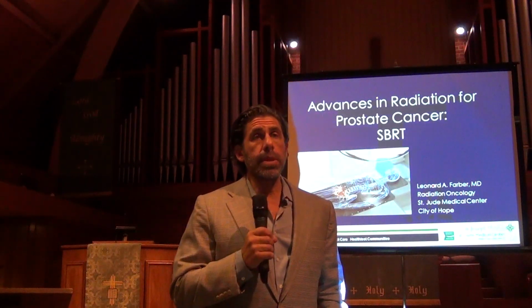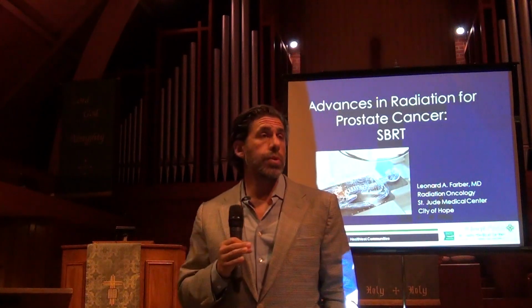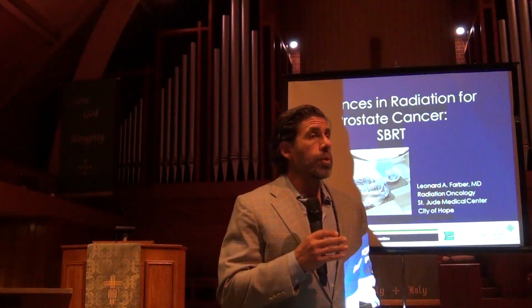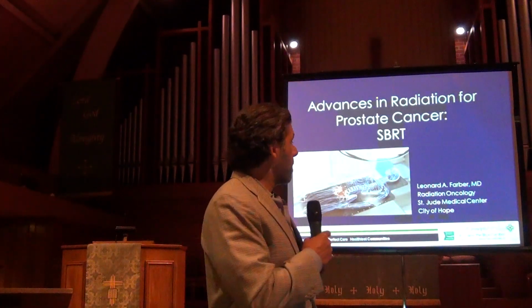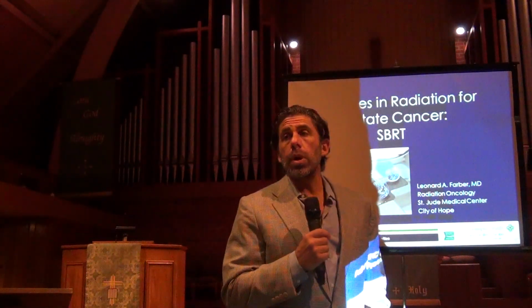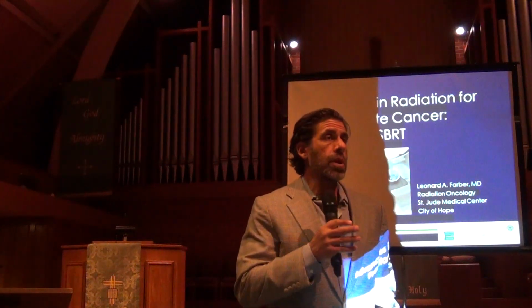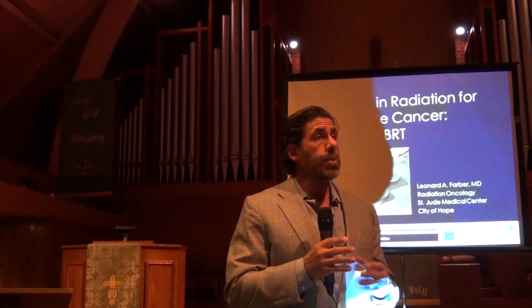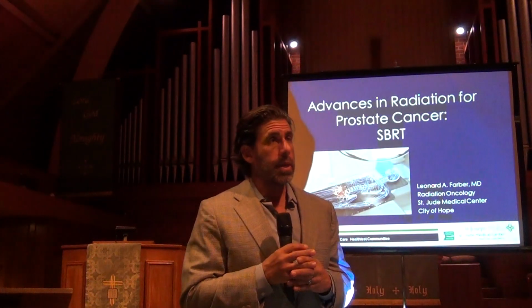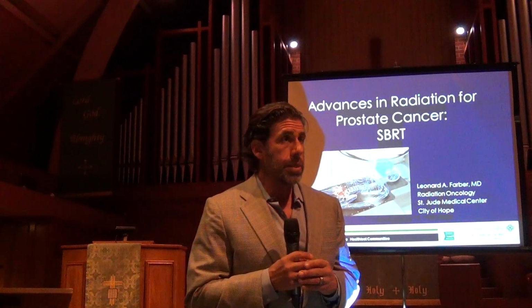When a patient presents with lymph node involvement, there's always been a question of whether we should even radiate, but there's more and more data showing a benefit. I quickly went through one slide where we are offering SBRT now in select patients to the entire pelvis area and the prostate itself. Most of us are doing it on study. I've done a handful of patients off study for logistical reasons.